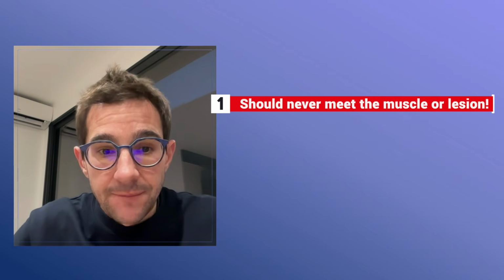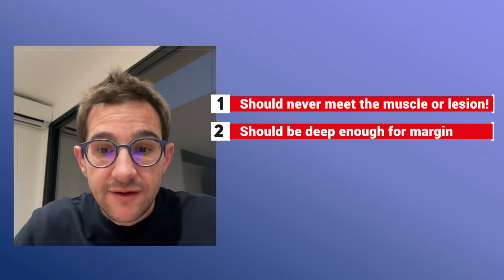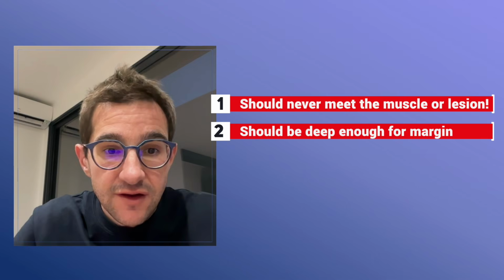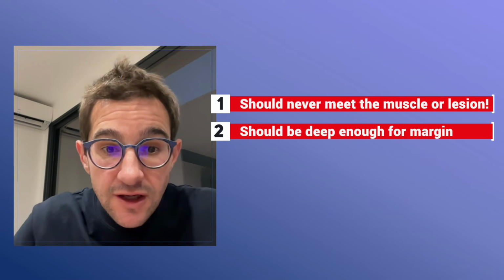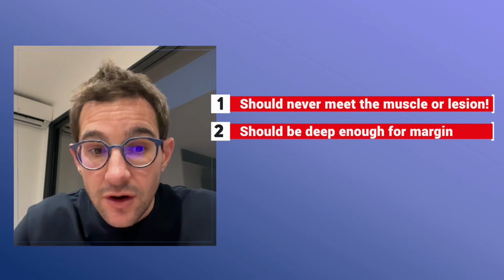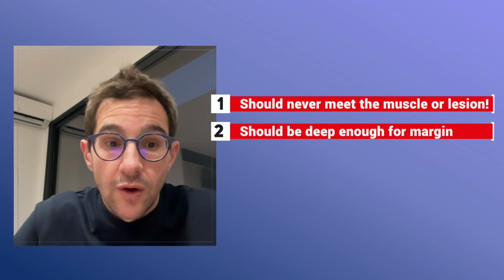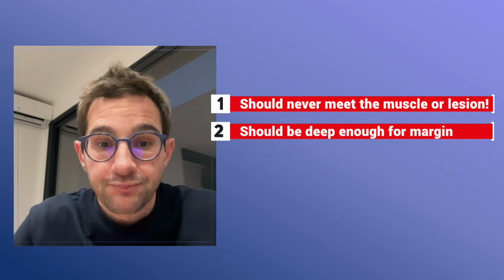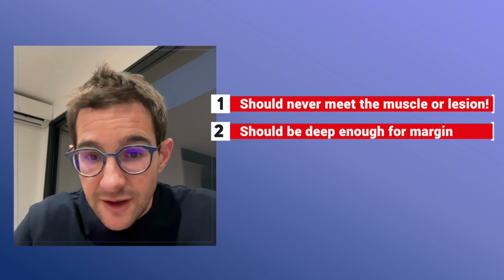Next case, the cut line should be deep enough for vertical margin. It is very important because ESD only makes sense if it is R0. If finally you cut the specimen or you damage the specimen, you are R1, and finally there is no benefit compared to piecemeal EMR. So you should be deep enough.